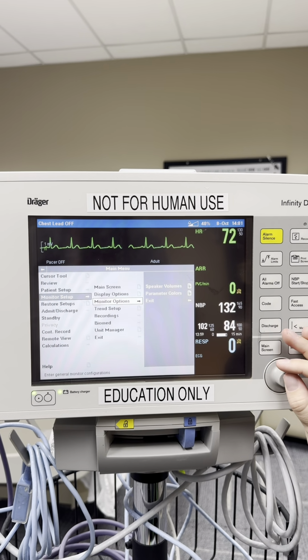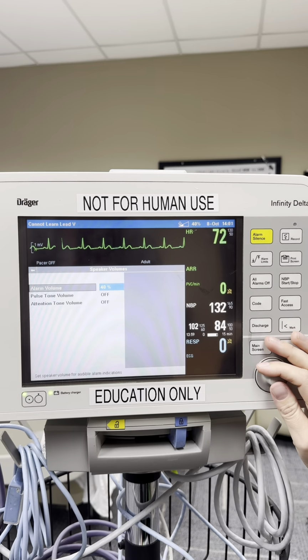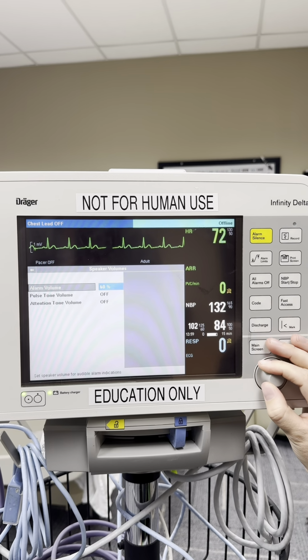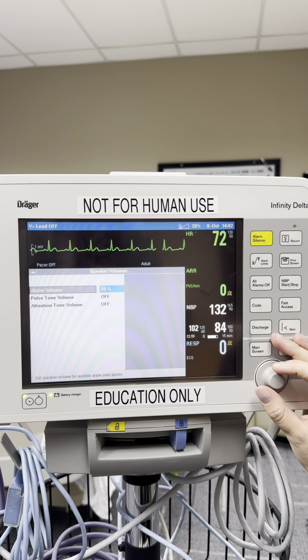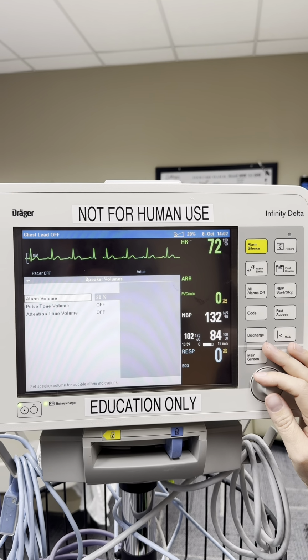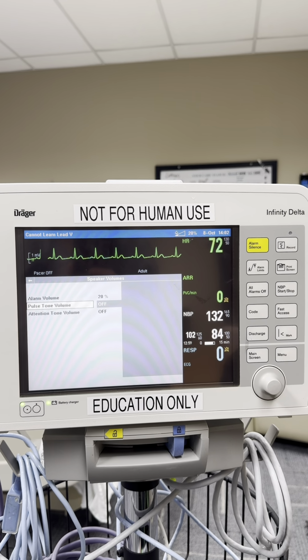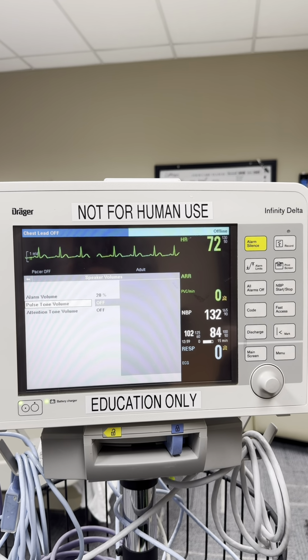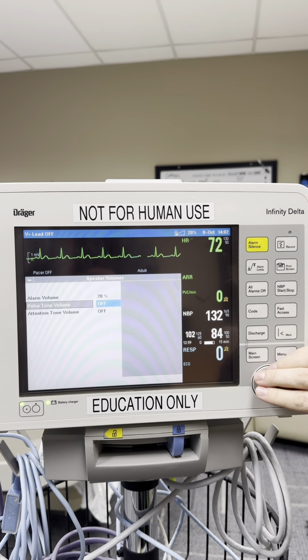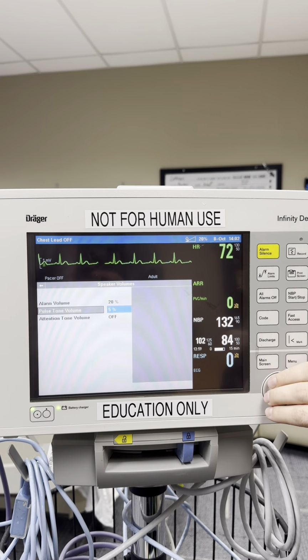And then monitor options, here is where you can change your speaker volume, so you can make your alarms louder or quieter, depending on your preference, patient preference. Here's where you can, if you get a patient and there's a pulse tone, that beeping with every heartbeat, you can change the volume here, and that will turn it up and down.